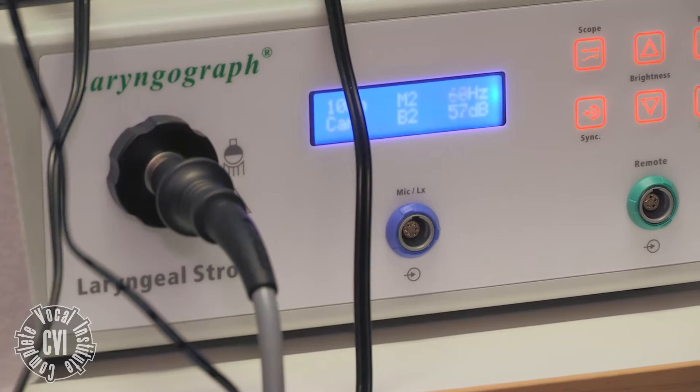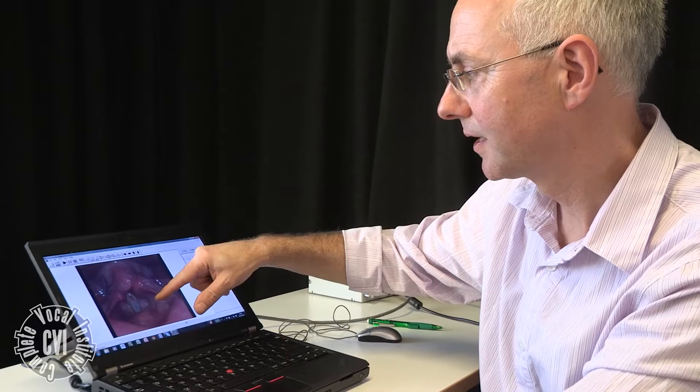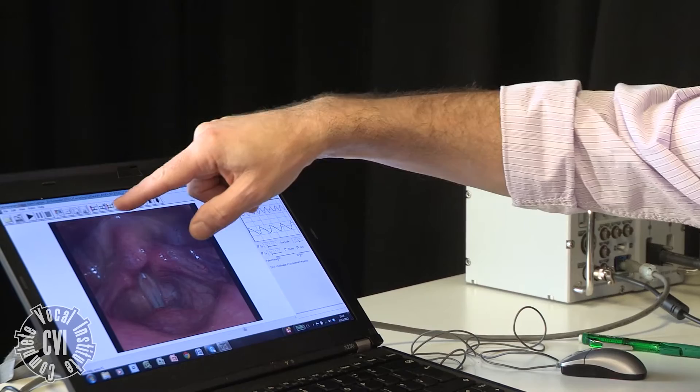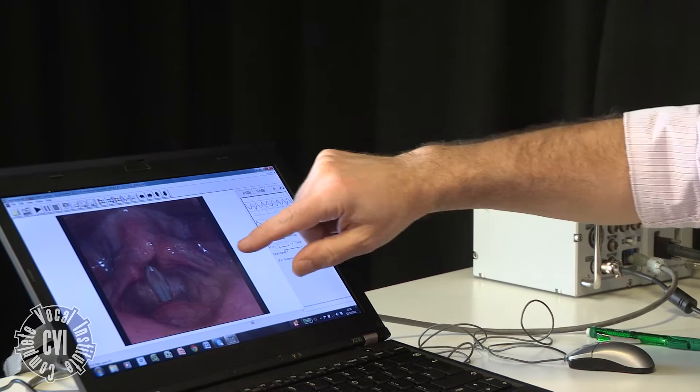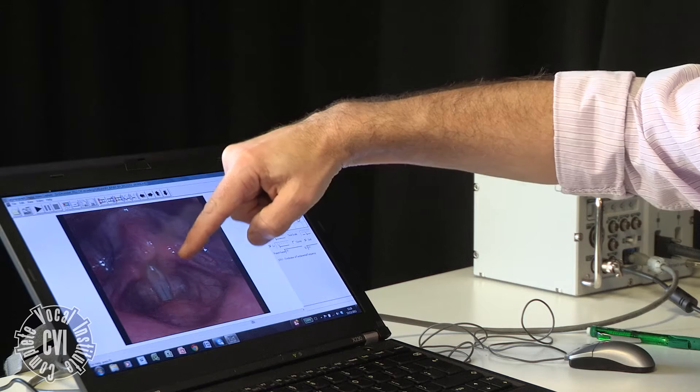What we have on the screen is a picture of the vocal folds — these white structures — and these are called the false cords on either side. Just to orientate you: this is the front where the tongue comes out of the mouth, and this is the epiglottis. This is the back where the swallowing passage starts, and that's the right side and that's the left side. And these are the vocal folds here, the white structures.